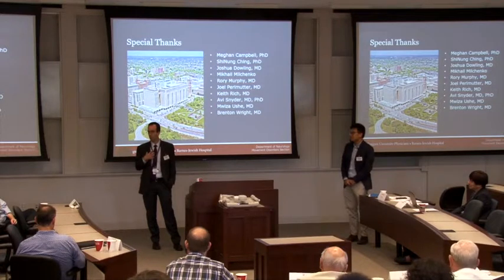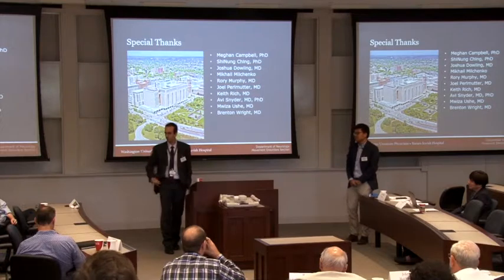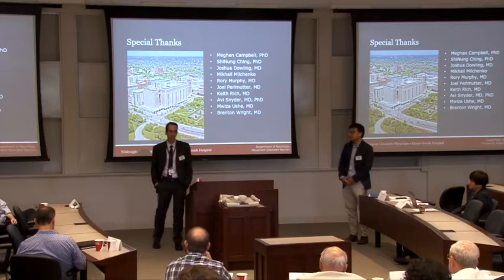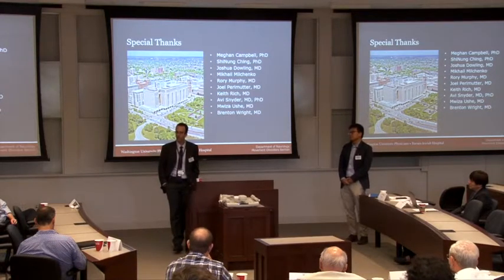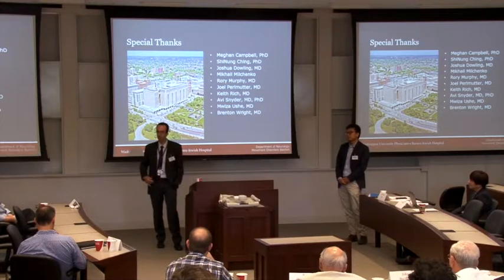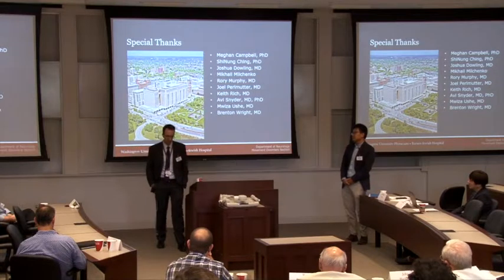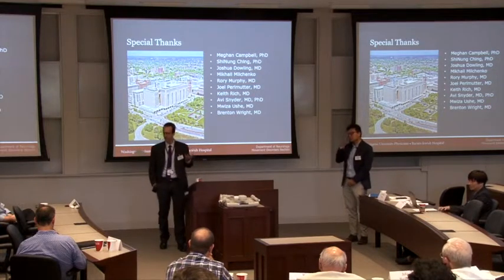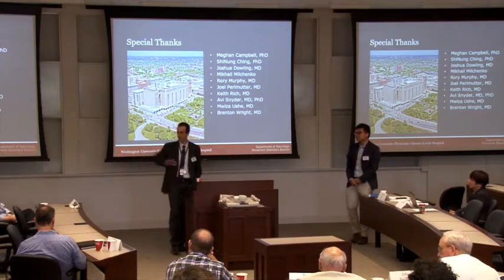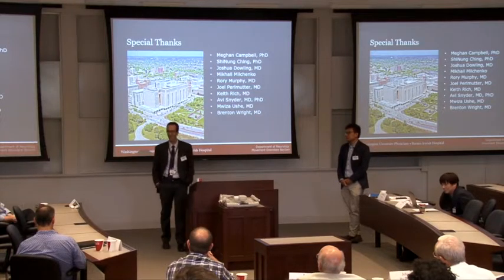My goal is to improve the quality of life of the patient, right? If they have less tremor and I see that on a Fitbit watch or another device, and that doesn't make their quality of life better, then it's not really serving the purpose of what I want to do clinically. But in the adaptive realm, those are some of the things we can do from a technology standpoint. Giving the patient the knobs and buttons, I think that's too complex. There are immediate effects, there are delayed effects. Animals want instant gratification, sometimes at the cost of delayed gratification. As clinicians, we're able to recognize that and program accordingly.